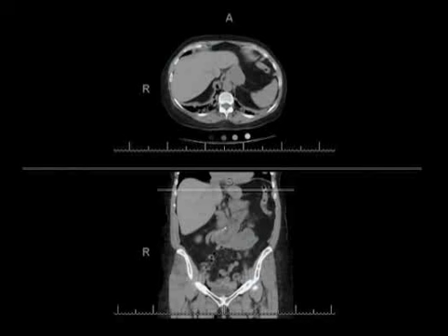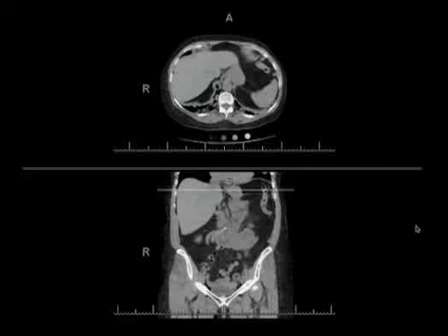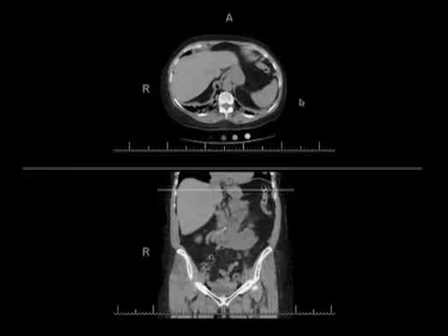The other thing that CT workstations let you do these days with multi-planar reformats is easily link the reformatted planes from the acquisition plane. For example, on this reformatted coronal image, we can see this white line corresponds to the location of the axial image. That's a feature I use often as well.